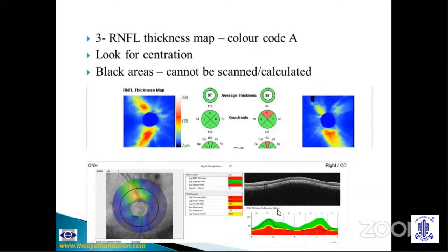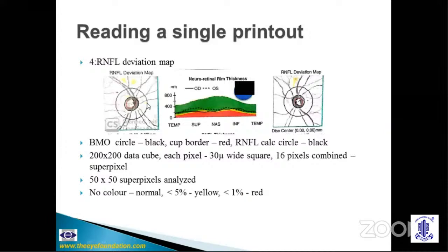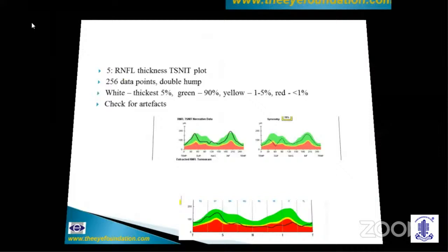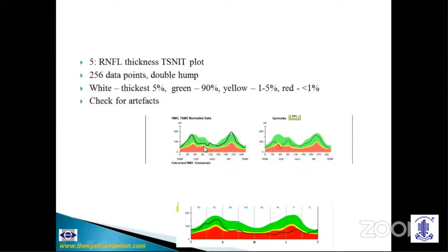Ganglion cell analysis is a 6x6 millimeter macular cube centered on the fovea — the Avanti uses a 7x7 millimeter cube. This provides a combined analysis of the optic nerve head alongside the macular GCC. There is a central hole in the ganglion cell map because the foveola is devoid of any ganglion cells. The same color code B applies: yellow is borderline and red is abnormal. In the TSNIT graph, there are 256 data points; this dip showing two peaks could represent a split RNFL — go back to the RNFL thickness map to verify. A dip into the red region may not necessarily be abnormal.